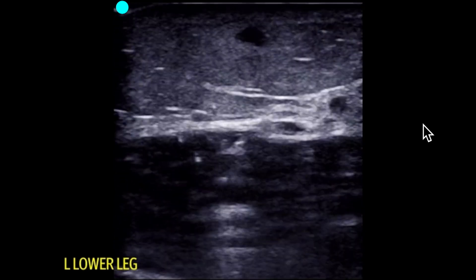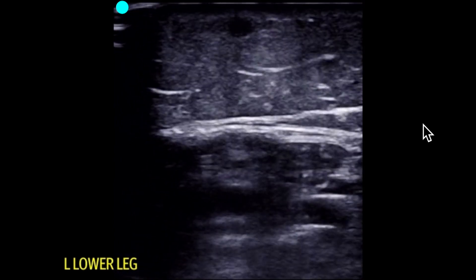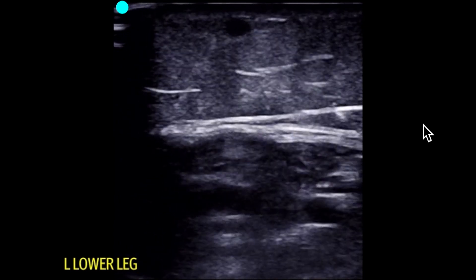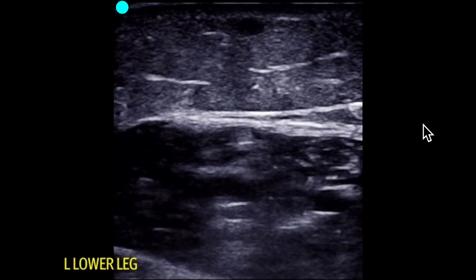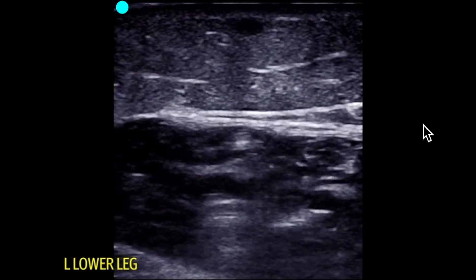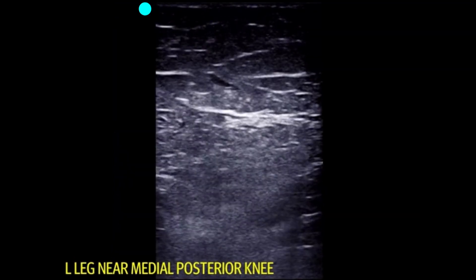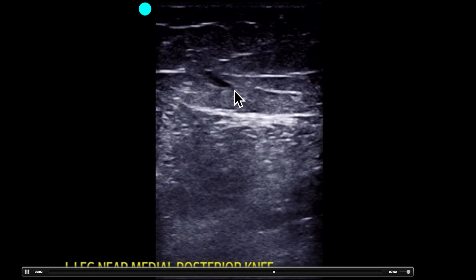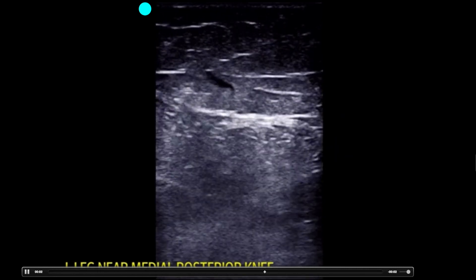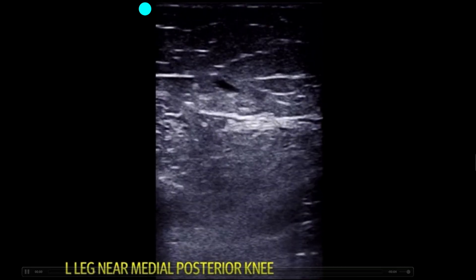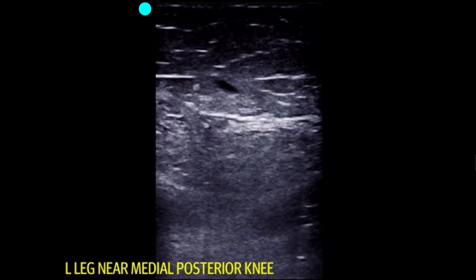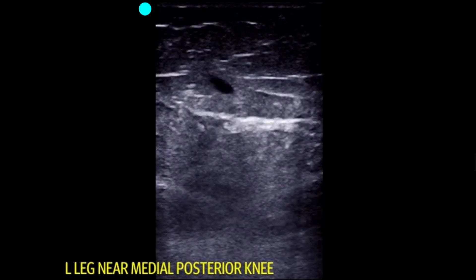We also don't want to confuse these for lymphadenopathy. Lymphadenopathy could be a chain of lymph nodes but they will be separate. This structure is all contiguous when we do this scan and we've been able to track this vein. Eventually we can track it to an area where we can compress and see it wink at us, and that helps us know we're looking at a vein. Following the course of it can also help us know that it's an isolated vein and not an abscess.